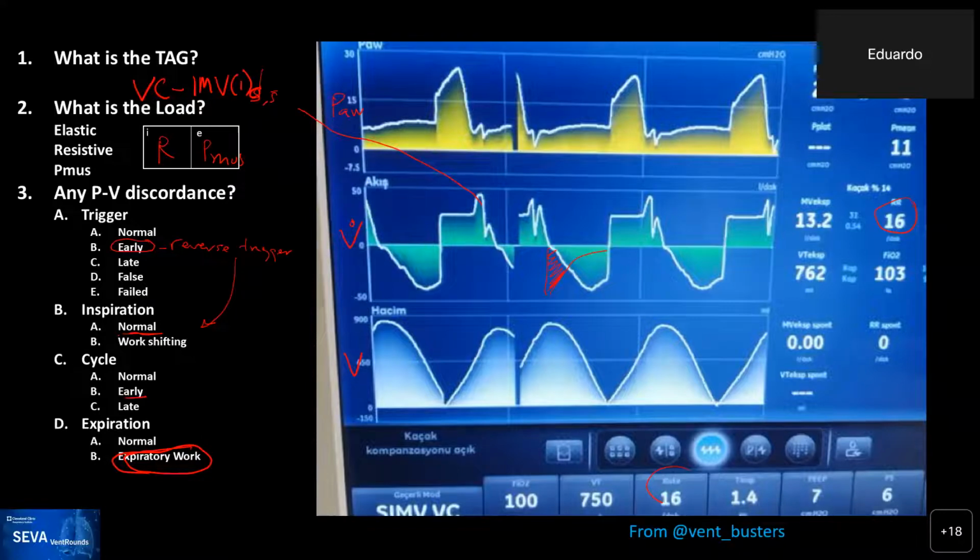If it still continues to happen, then this is usually a manifestation that the patient, in our view, may have toxicity from the sedatives, and the question has to be, well, do I need this patient to wake up? Is the patient gonna tolerate that or not? And so that would be my input, is initially trying to drop the rate, decrease the sedation. If I was gonna change the mode, I probably would do pressure support initially to see what the patient is doing. But it's evident that the patient is getting very large tidal volumes.